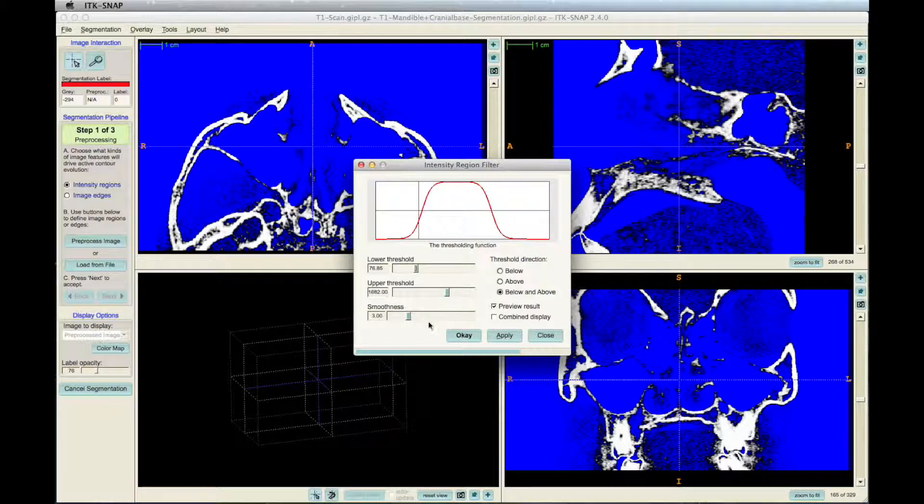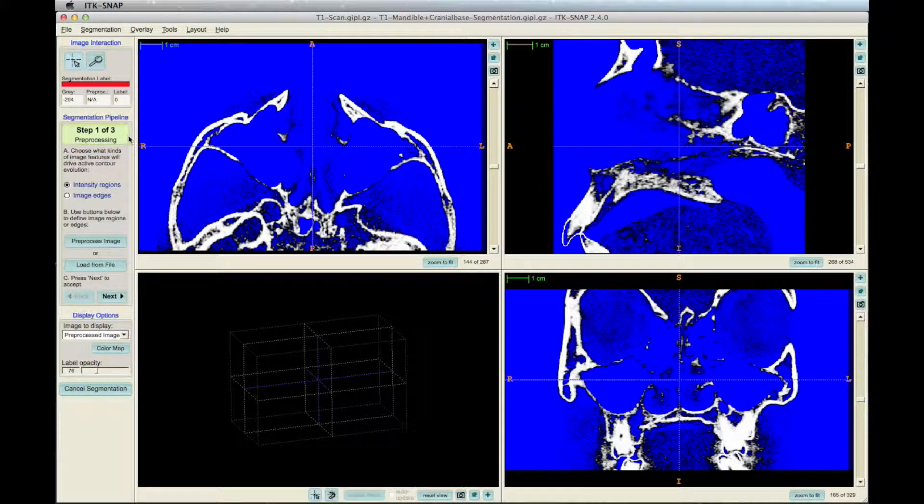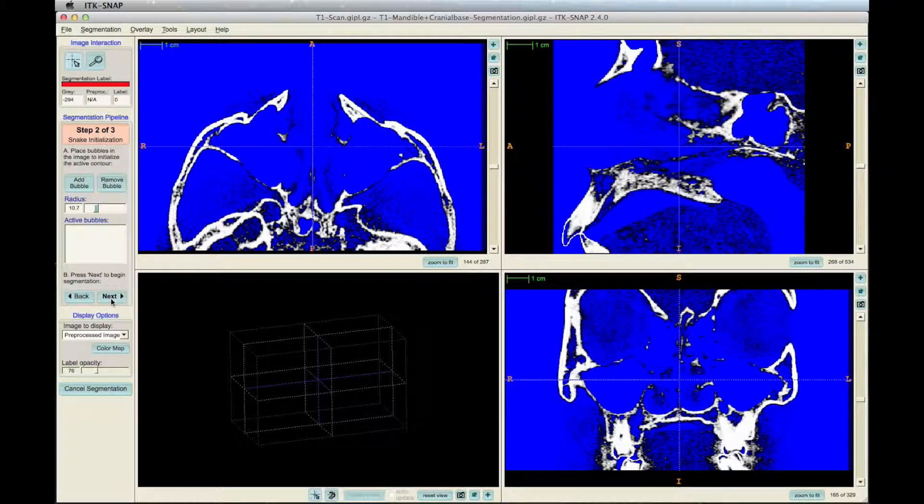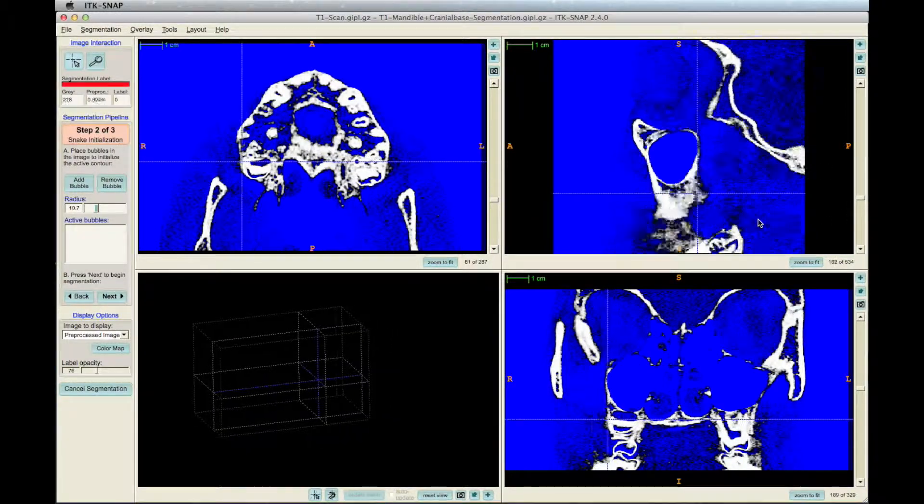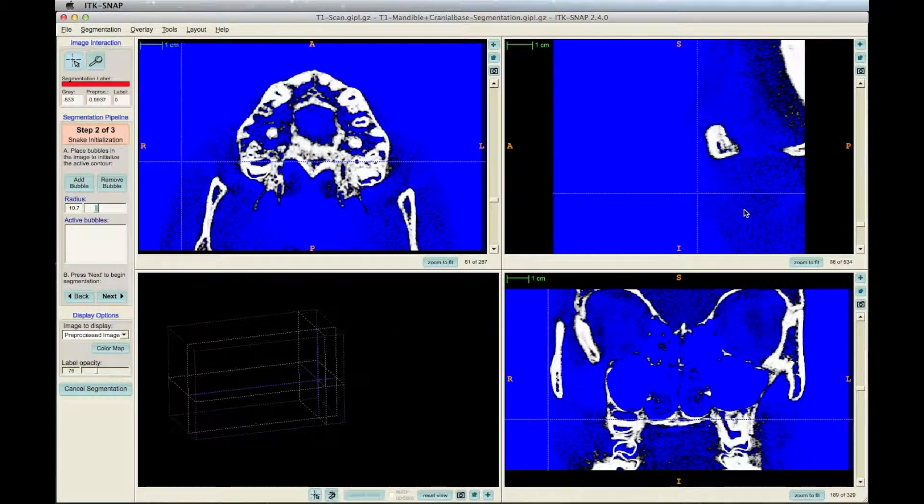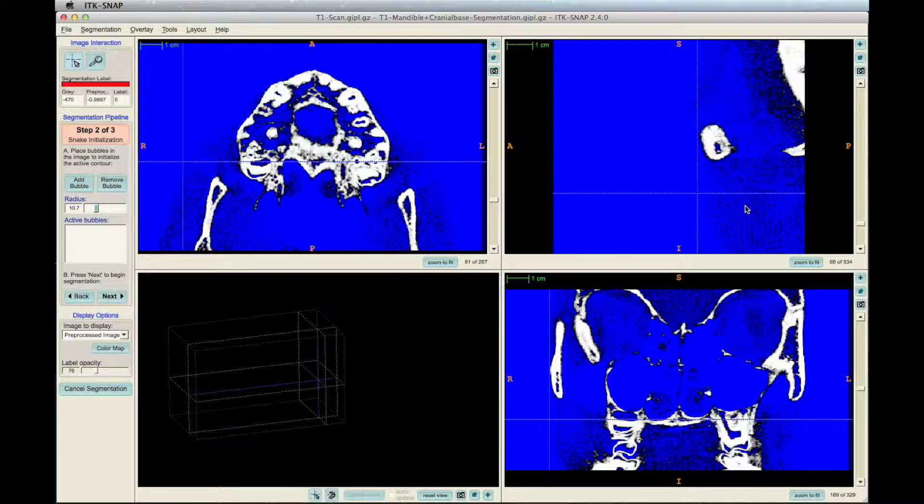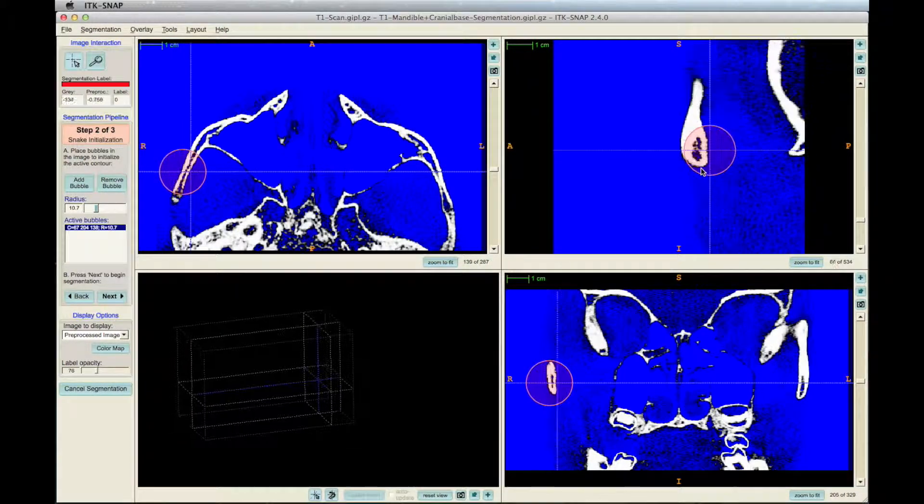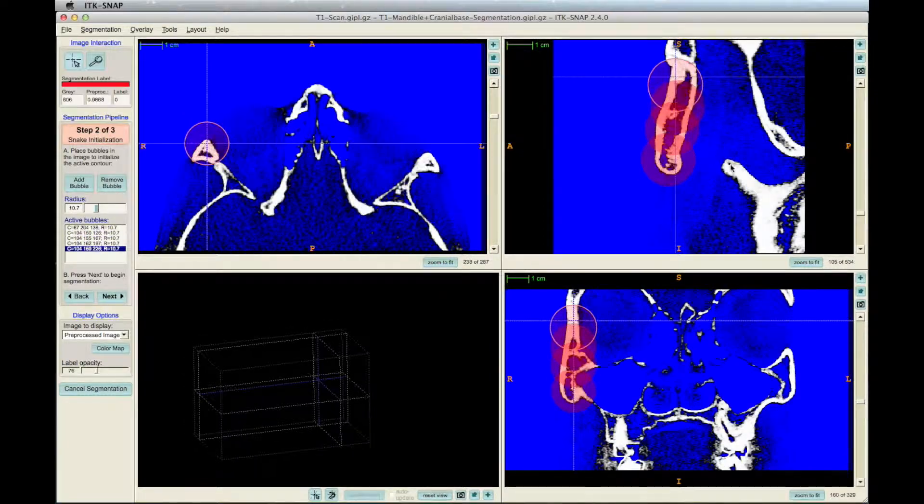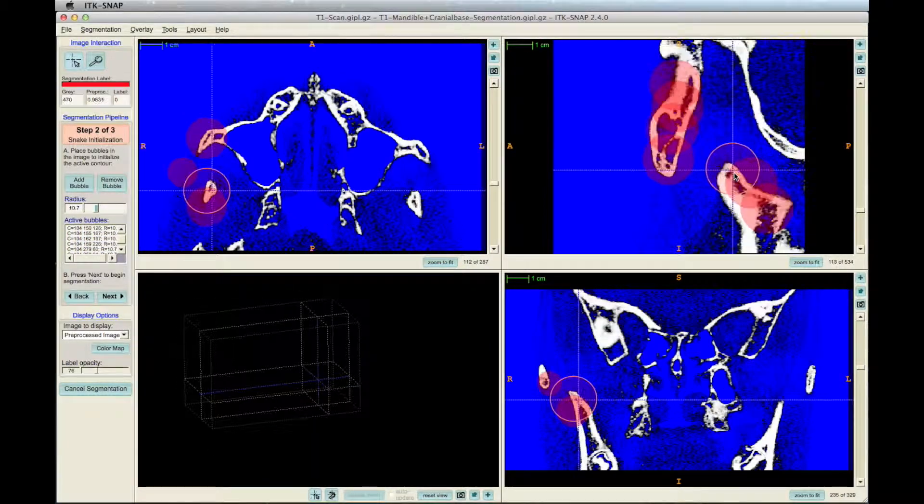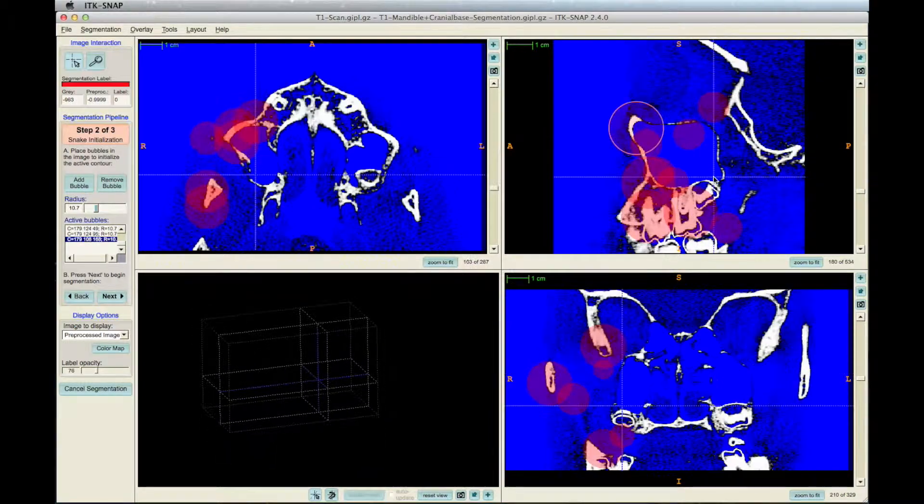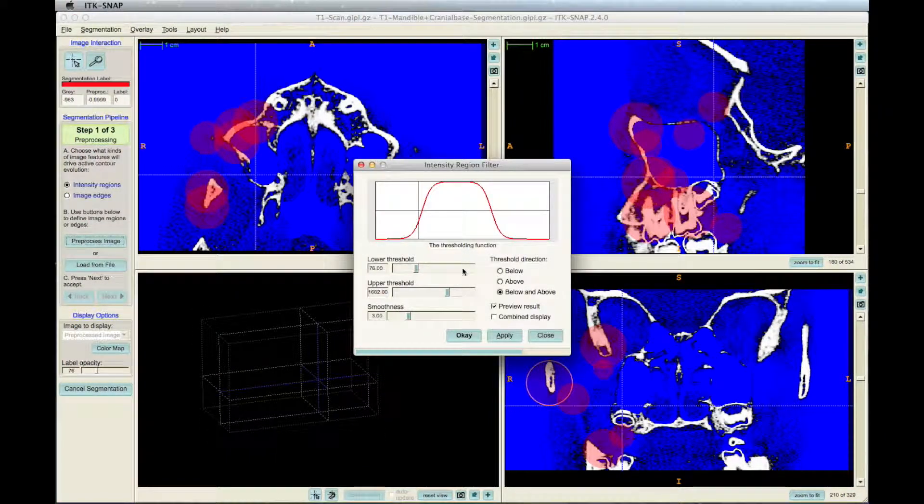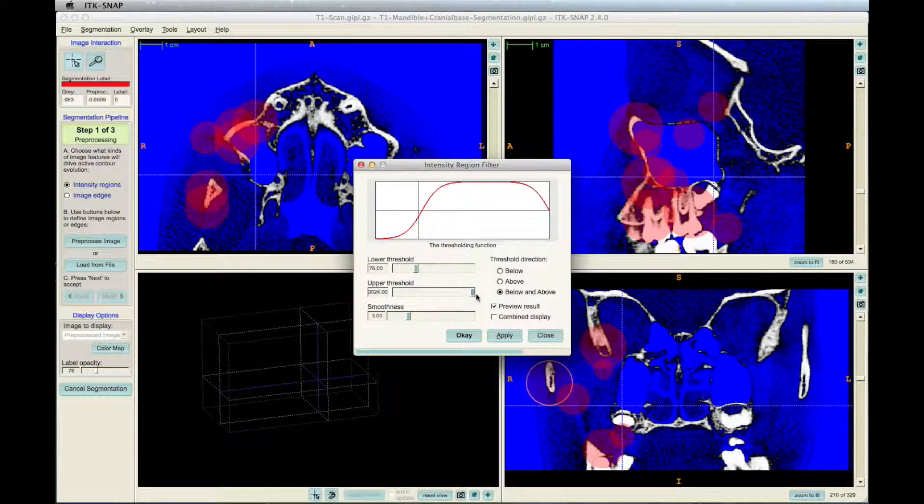When finished, click OK, then click Next. Now it's time to add bubbles to the scan. Press and hold the left mouse button, then press the plus keyboard button. This will add bubbles to the scan where your cursor is located. Keep the bubbles mainly on the white bone. If some of the bubbles inevitably go into the blue or black sections, that's OK. It will shape to the bone in the next step.